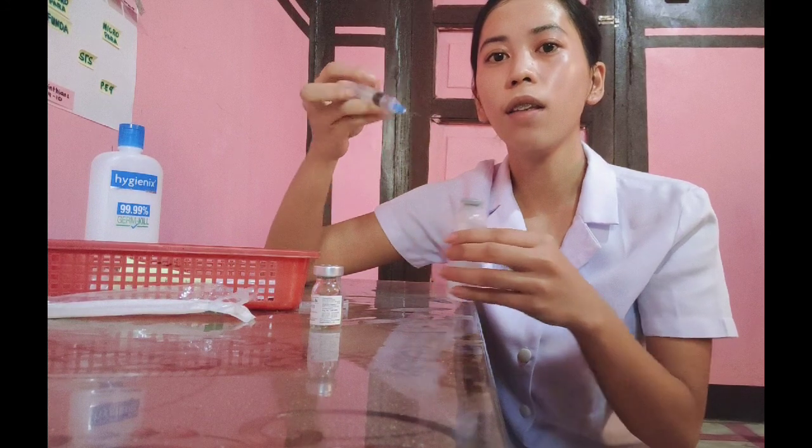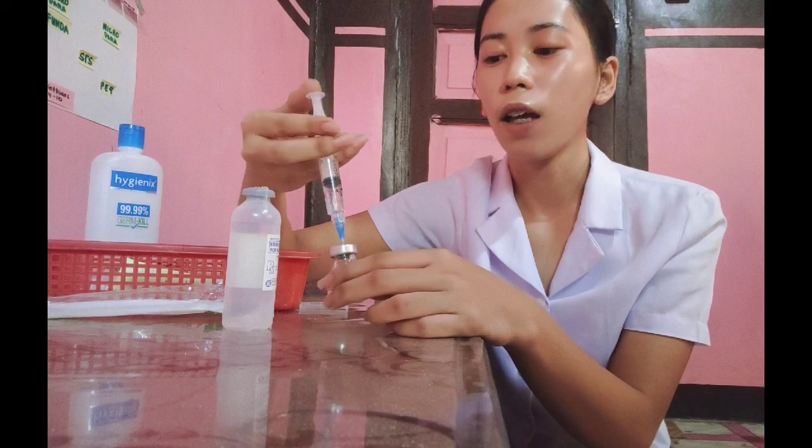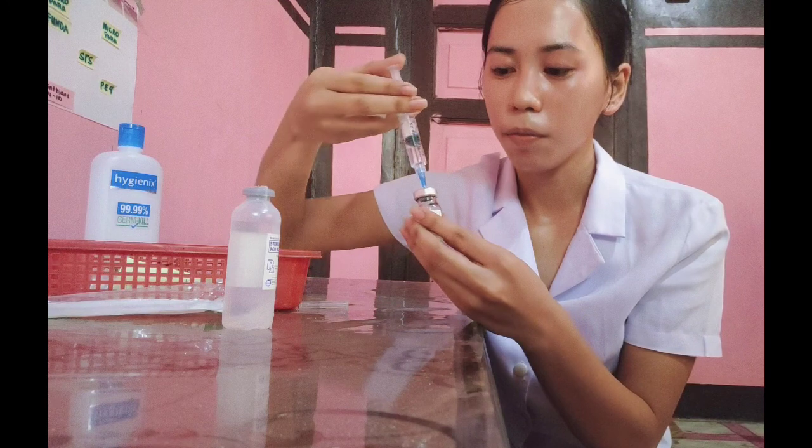And then add the amount of sterile water or saline diluent indicated in the direction into the vial and observe sterility.